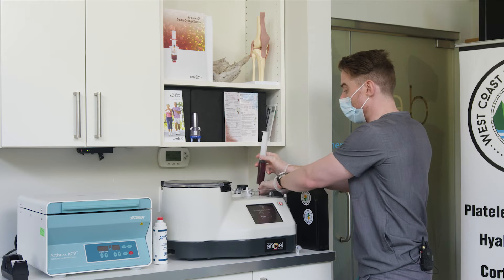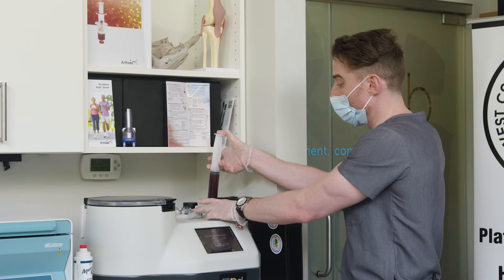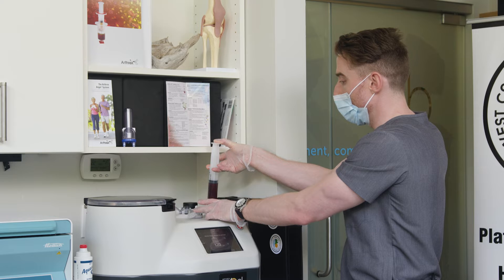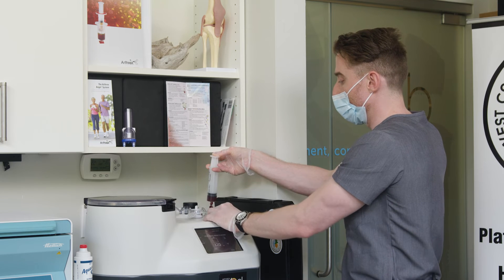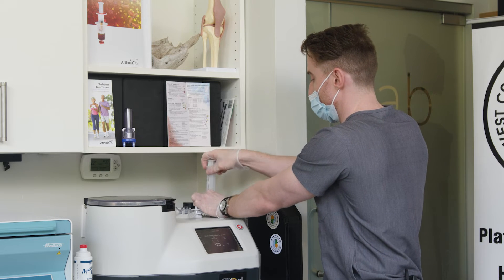This is going to be collected in bag one. It'll be spun in the centrifuge device. This machine is very easy to use, and the setup yields one of the most concentrated products on the market. It does take about 20 minutes with 120 ml of blood. You'll see the three chambers fill up and then separate all those fluids. We'll check back in 20 minutes to see our finished product.